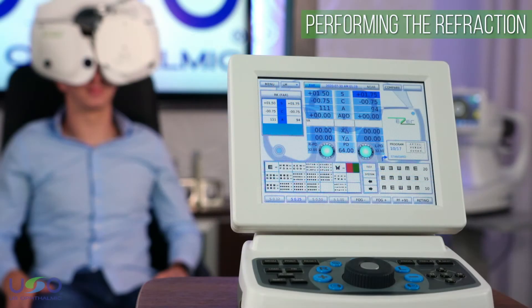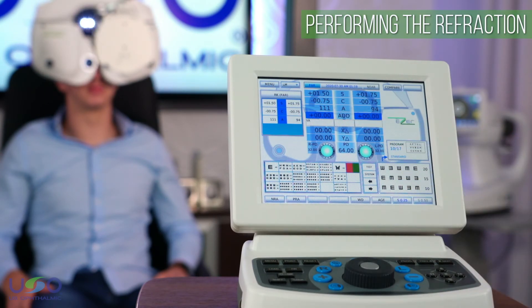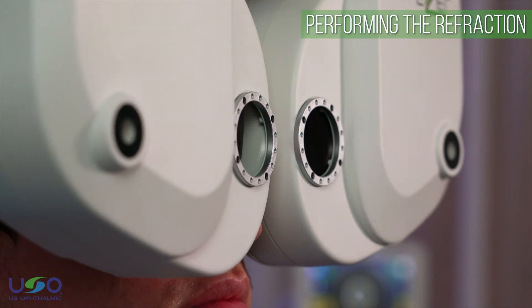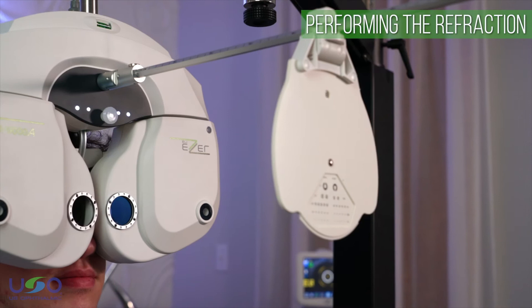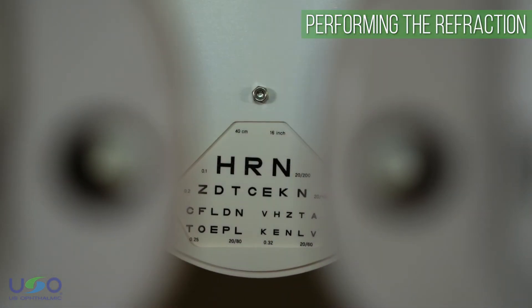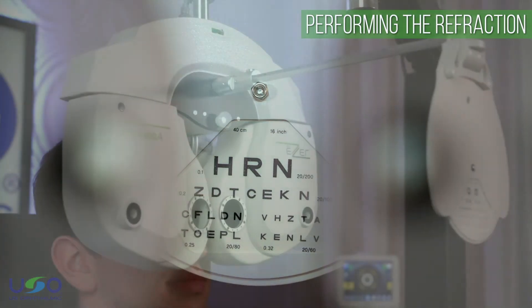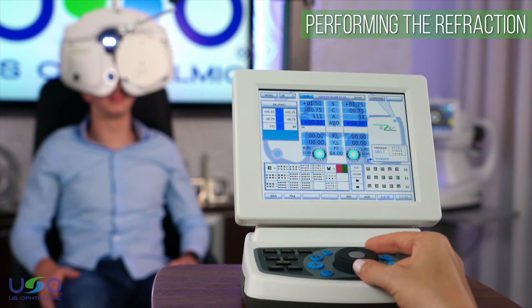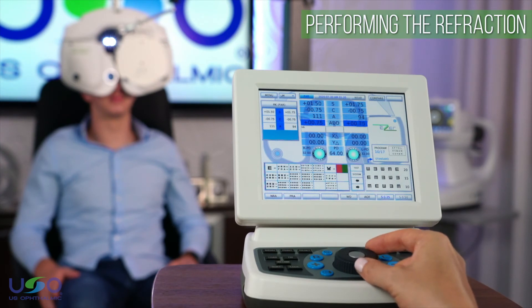In the case of presbyopic patients, you can evaluate the near vision by selecting the addition icon. The Easer EDR-9000 adjusts the convergence and interpupillary distance of the refractor head for a comfortable evaluation of near vision. The lighting system installed in the digital refractor head illuminates the near chart without the need for an external light source.